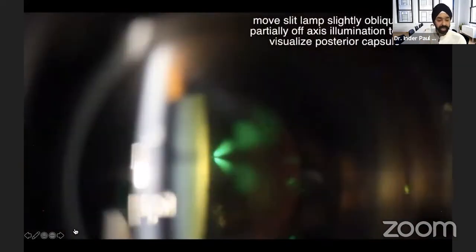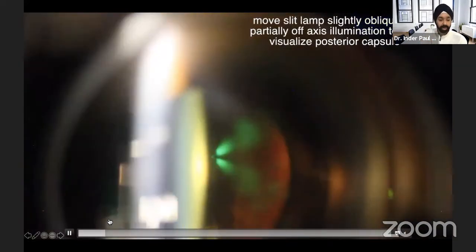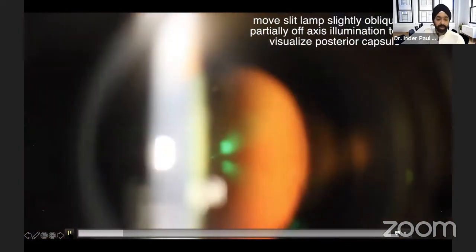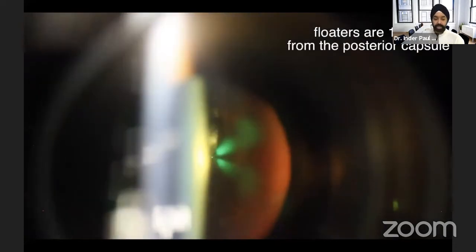Just to show you the efficiency of energy. This is something I do not want anybody out there to do at home, but I want to show you something. This is a patient who had a floater right behind the phakic lens, came from London and wanted me to do a procedure. I said no, but she said, please, doctor, please. So I went ahead, and this is at about 1 millimeter from the posterior capsule. I had about a 100 micron posterior offset on the laser.